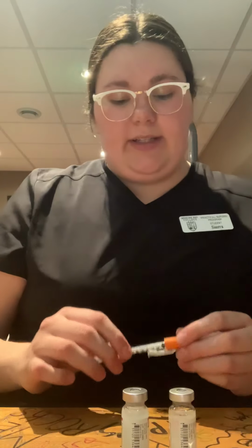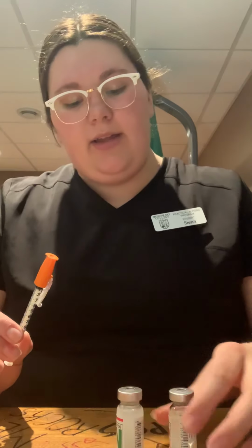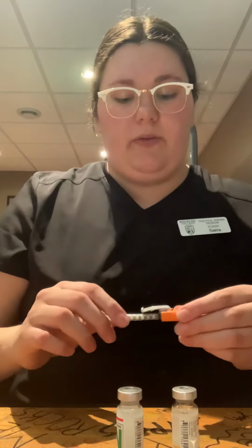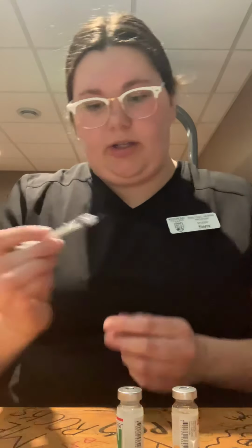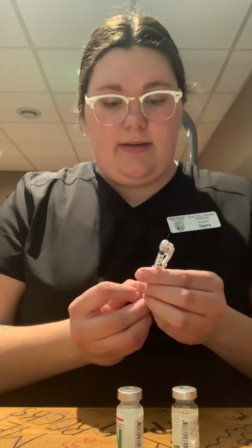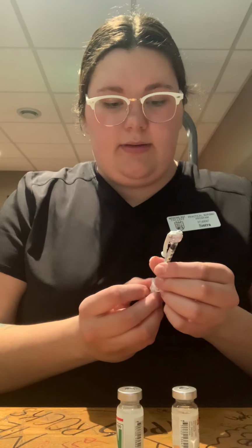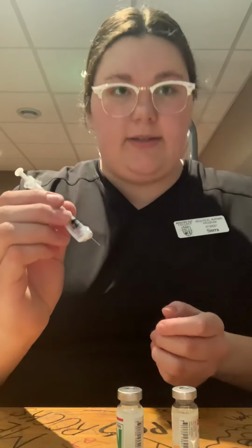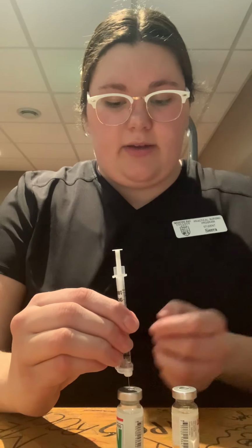So I will be putting 10 units of air into the Humulin N vial and then 20 units of air into the Humulin R. So we're going to remove our cap. We're going to get 10 units of air and we're going to go right into our Humulin N vial.